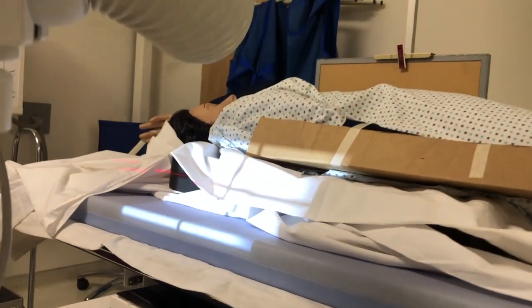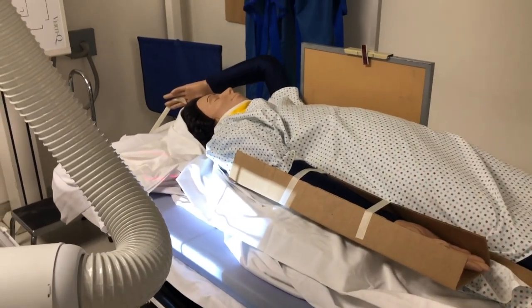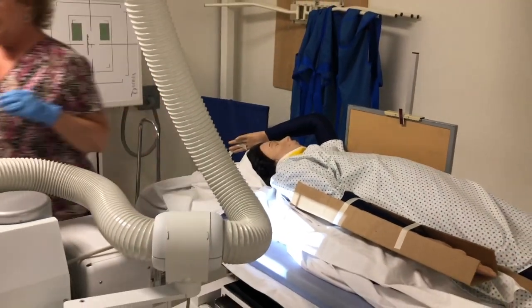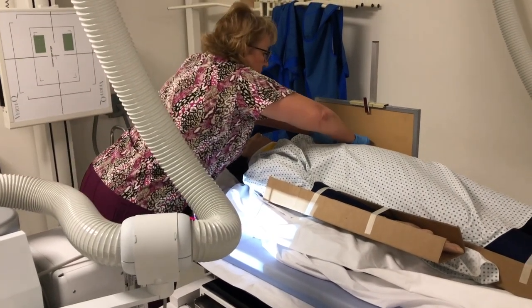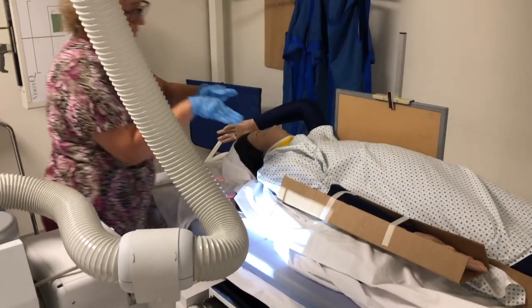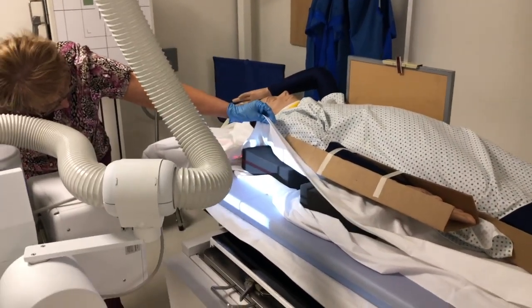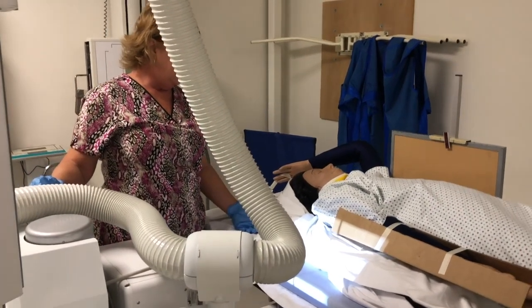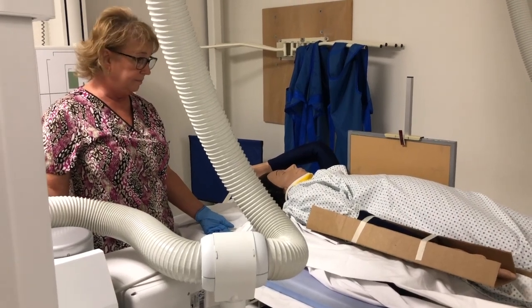Okay, and I'm going to collimate what I consider to be not much past the thoracic spine. I can place my marker down low so that it's above her thoracic spine, but still on the image. And if the patient could hold their breath, I would have them exhale and hold their breath. If they couldn't, I would try to capture them on expiration.